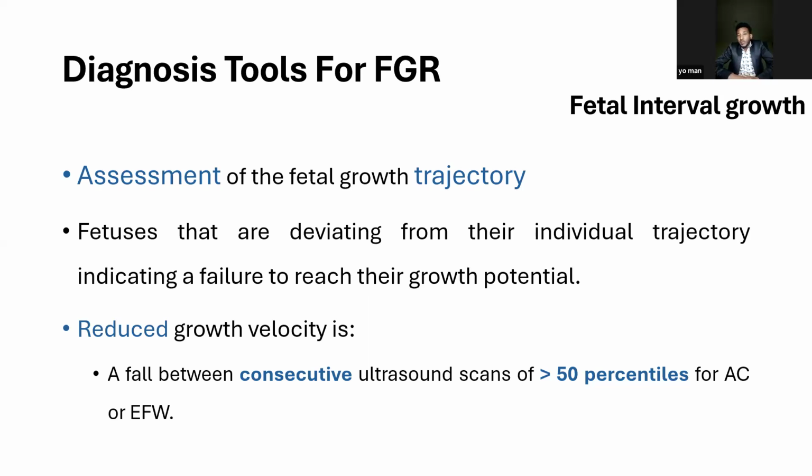If the difference in those percentiles is above 50, then that's the criterion for calling a fetus FGR.